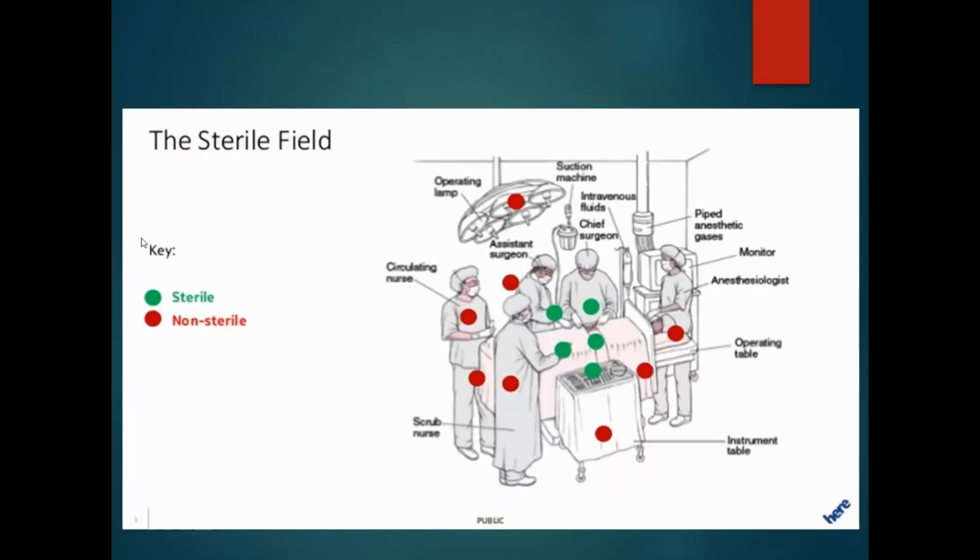And this is just an example of the sterile field. So again, this patient is the center of the sterile field. So this is all sterile. The gown is only sterile from mid-chest to table level. And like I said, this is going to vary depending on height. The tabletop is considered sterile. The hands, which are above table level, are considered sterile.